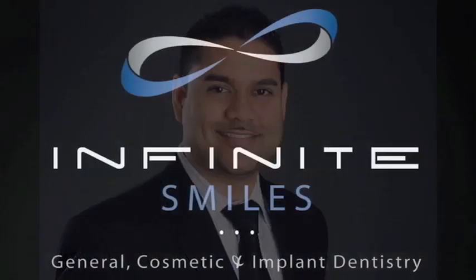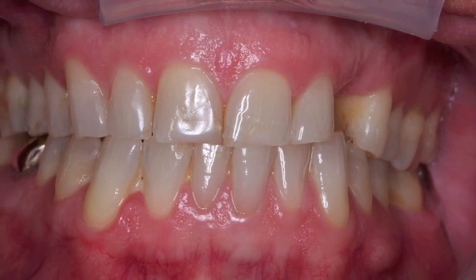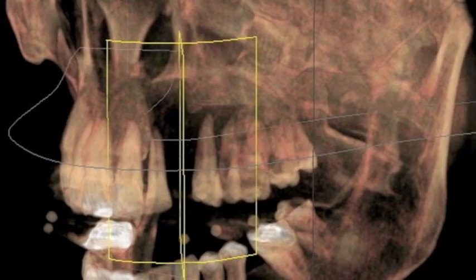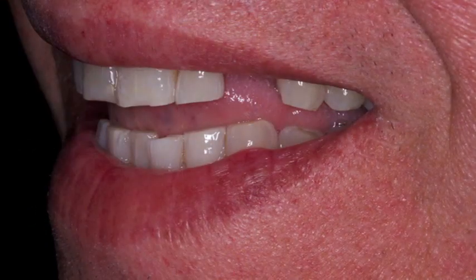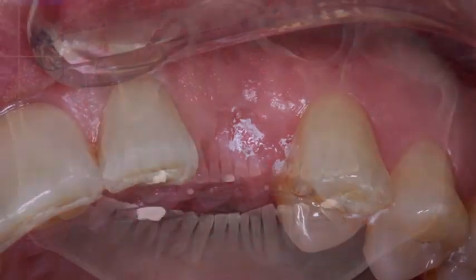Today I'd like to share a clinical case using Cerec and Galileos integration. This patient is congenitally missing tooth number 11. As you can see, there's a large defect but adequate soft tissue. Clinical examination reveals a ridge that is in excess of 12 millimeters in width and 20 millimeters in height. But without Galileos, one would not realize that the true width of the ridge is only 5 millimeters.